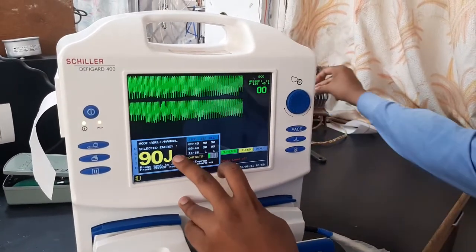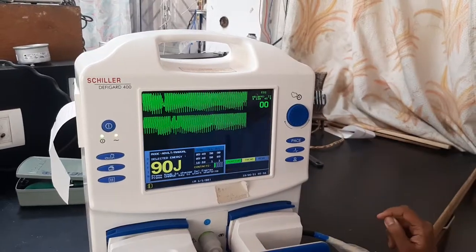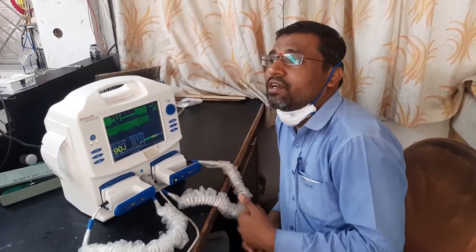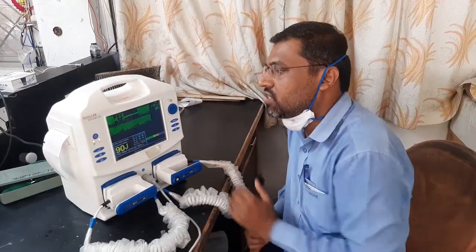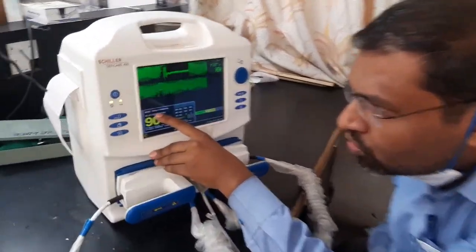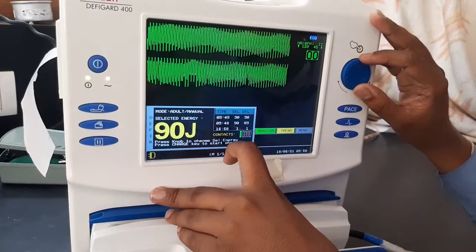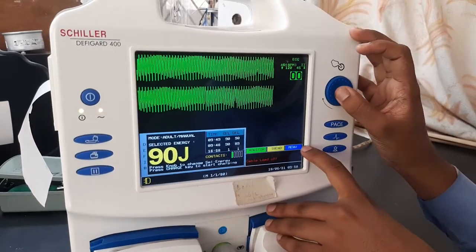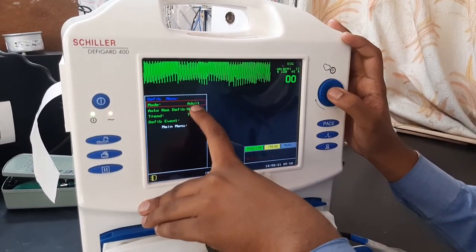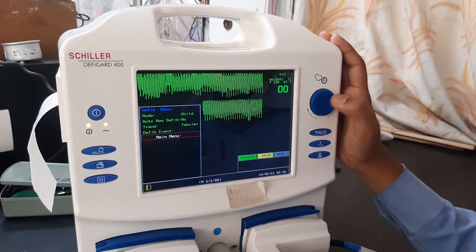Most of the time, doctors keep the machine in manual mode. One more thing — sometimes you try to select a particular energy but it doesn't get selected in the machine. This happens because the machine has two modes: adult and child. To change from adult to child, go into menu and select 'Defib' — you can see the patient type option. I am going to set it to child and exit.